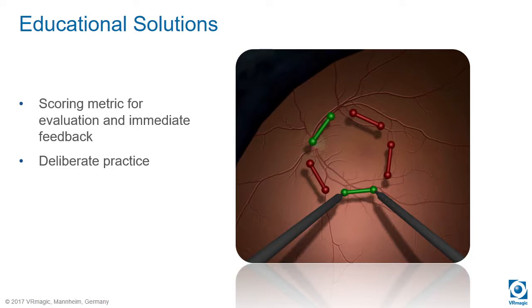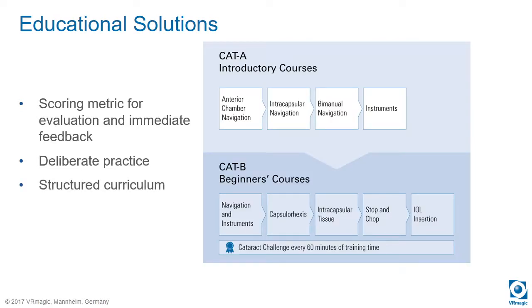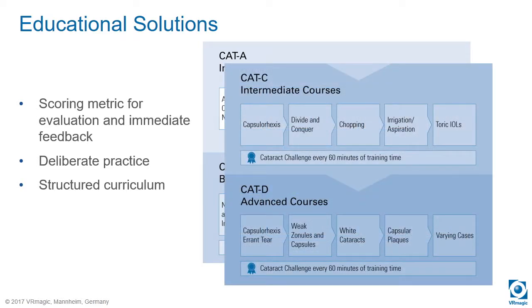I know that most doctors that are training on our systems don't like these kinds of tasks because they are too far away from real surgery, but they are really helpful when you need to improve on your basic manual skills, much better than doing 100 complex surgical tasks in the simulation or on the patient. We have structured curricula for all the tasks that we have that typically start with some introductions with abstract tasks, then provide easy surgical steps and continue with more complicated surgical steps and complications and complicated cases that we will rarely see as a beginner in real surgery.